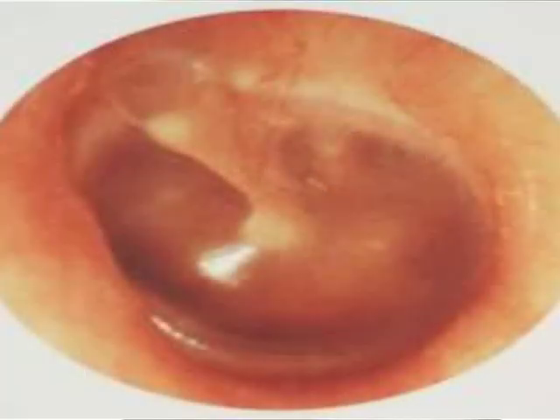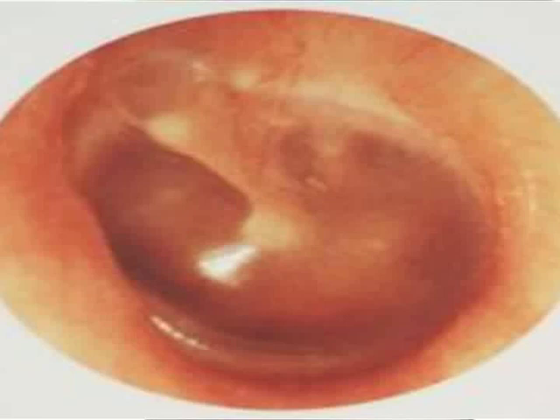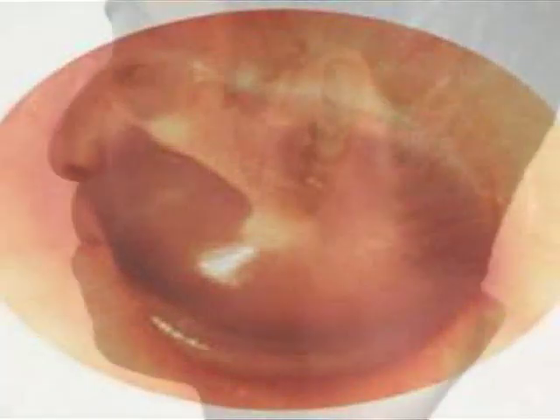We must also observe the light reflex on the inside of the tympanic membrane. The light reflex is the reflection of the otoscope on the tympanic membrane. For the left ear, the light reflex will be in the seven o'clock position. For the right ear, the light reflex will be in the five o'clock position. Just remember that.